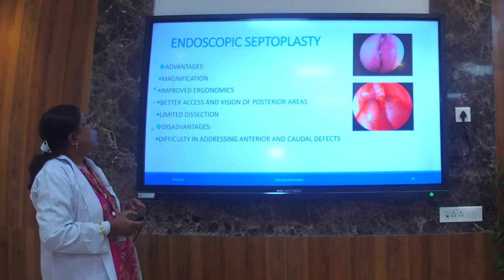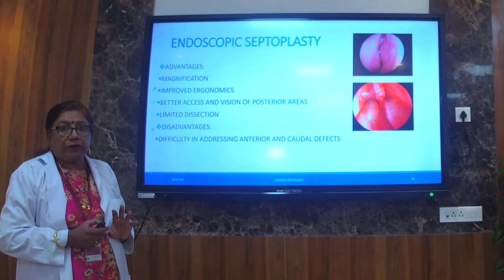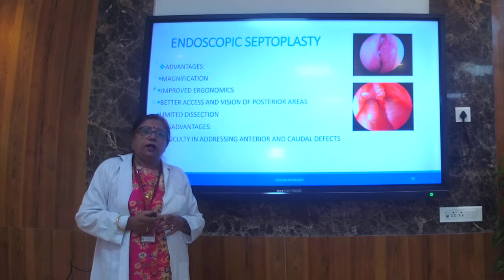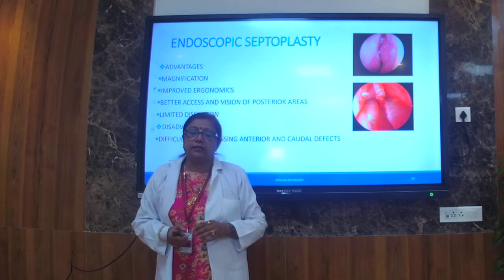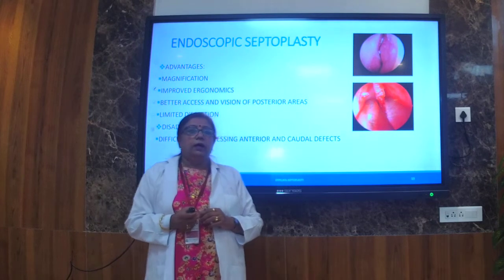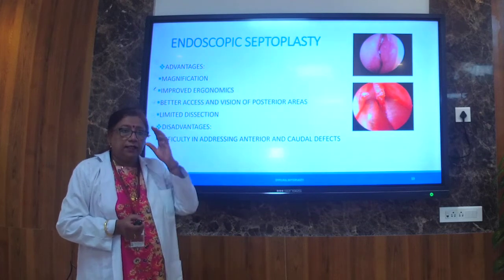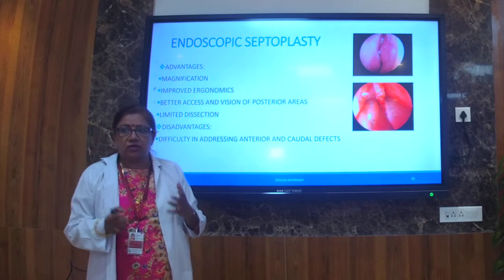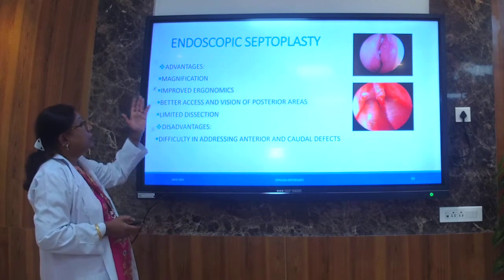So as I told you, this will finish your open septoplasty. Now, I would like to tell you something about endoscopic septoplasty. Nowadays, we are also doing endoscopic septoplasty. The procedure is actually the same as septoplasty. Only thing is that for septoplasty, we are using an endoscope, that is 0 degree. So this is how we do endoscopic.